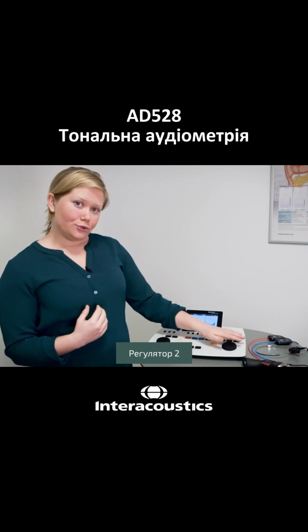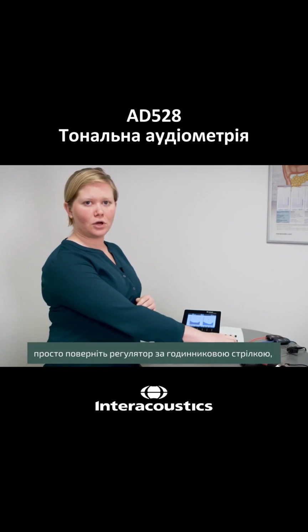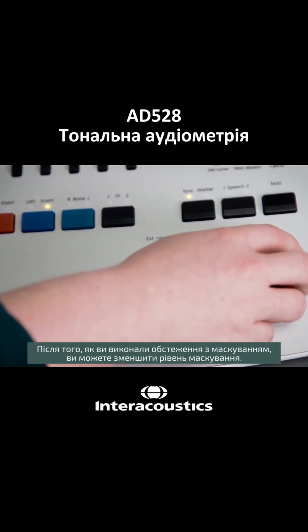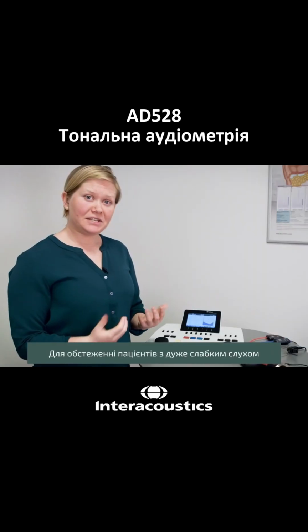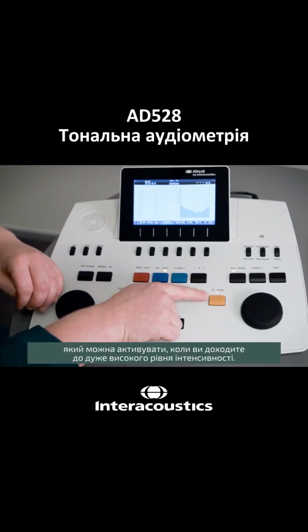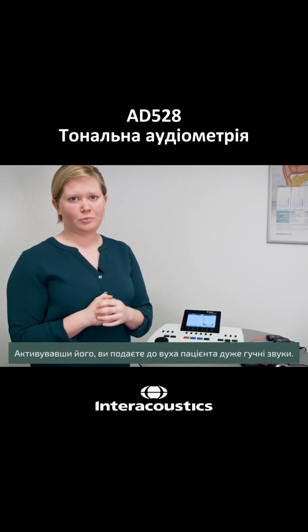Over here around wheel 2, you have the masking, and the masking can be used during the session just by turning the wheel on, increasing the level. Once you have masked and you're done, you can then decrease the masking level by turning the wheel completely counterclockwise. In case you have a patient that's really hard of hearing, we have the extended range that becomes enabled when you get a really high intensity, and you can then enable presenting loud sounds to the patient's ear.